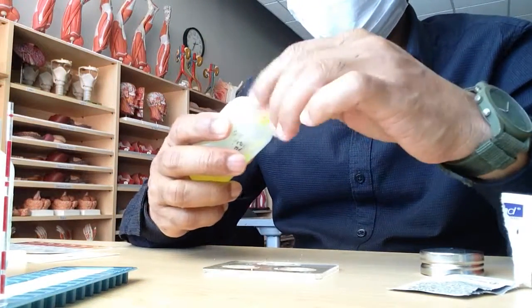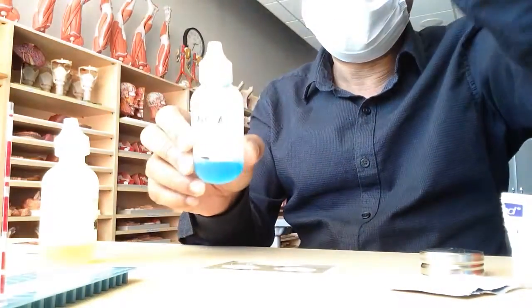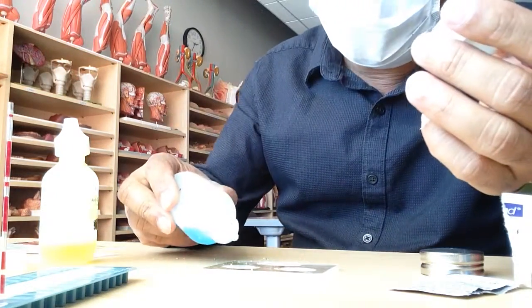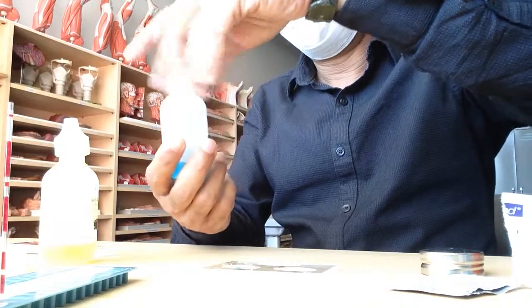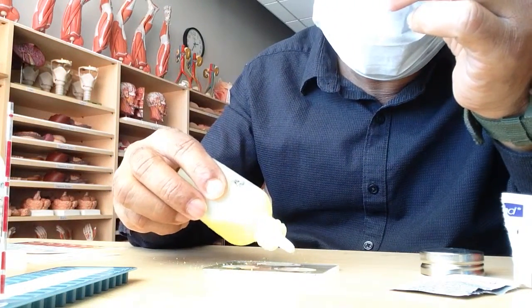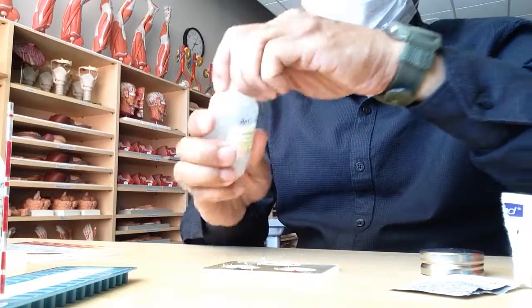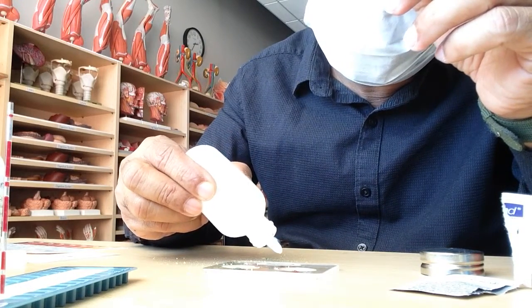Mix the serum. This is anti B. So first get anti A, and this serum anti A will go to well A. Anti B, this one will go to well B, and anti RH or anti D, this one will go to the well marked with RH.